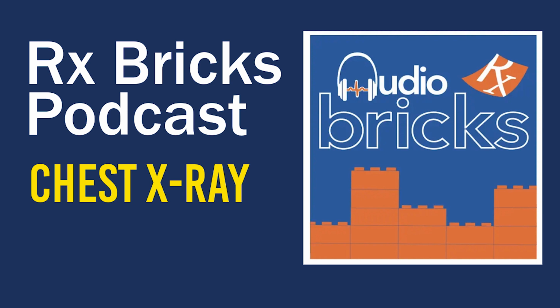Now, let's transition to discuss a systematic approach to reading a chest X-ray. A common and easy to remember approach to systematically analyze a PA chest X-ray is the ABCDEF approach. A, for airway. Check the trachea in the upper mediastinum. Because the trachea is air-filled, its center will appear dark. It should be midline, so that spinous processes of the upper thoracic spine are visible through the tracheal air.